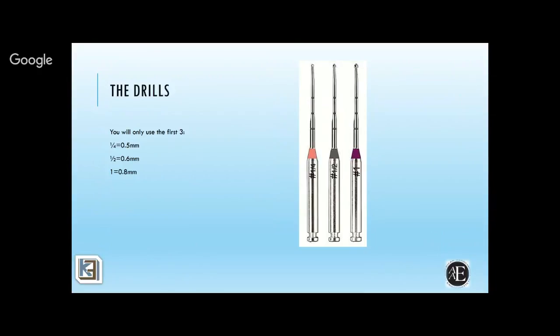When you go down from 100 microns to 50 microns, that's 50% more accuracy, or 100%, depending on where you're looking at. Every little micron will make a huge difference on whether you're gonna be right on top of the canal, off to the side a little bit, and if you're gonna find it or completely miss it.